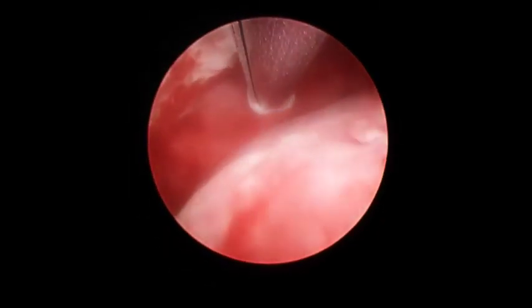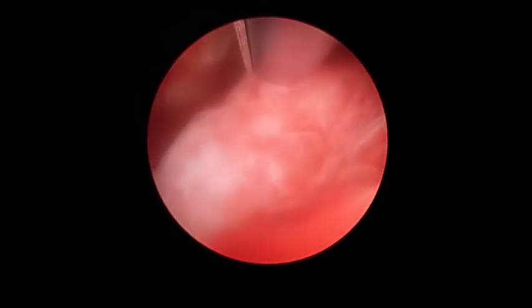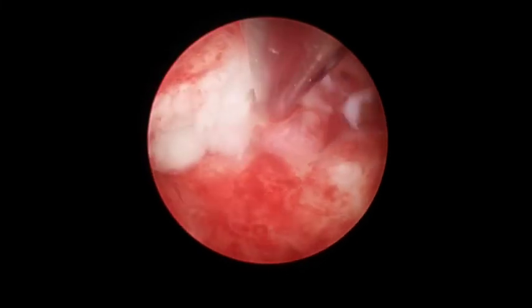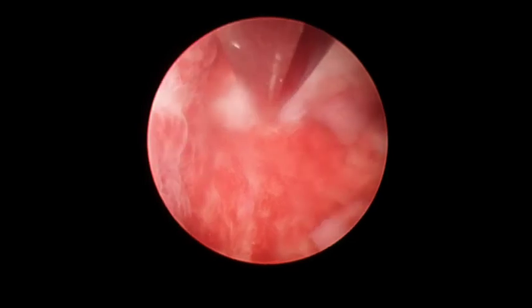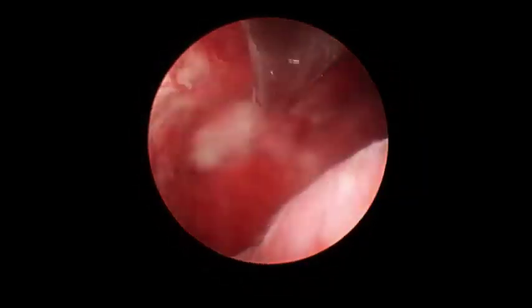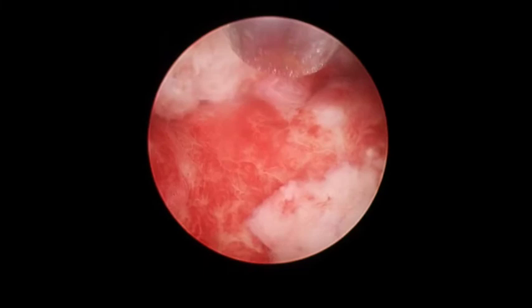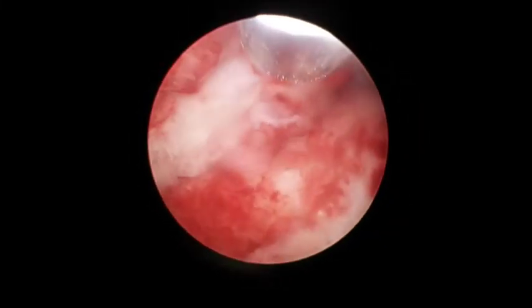This fibroid is resected with the hysteroscopic tissue removal device. Resection of the base of the anterior wall fibroid is also completed, and a normal uterine cavity is restored. The specimen is sent to pathology, and the final report came back as a fibroid with cystic degeneration.